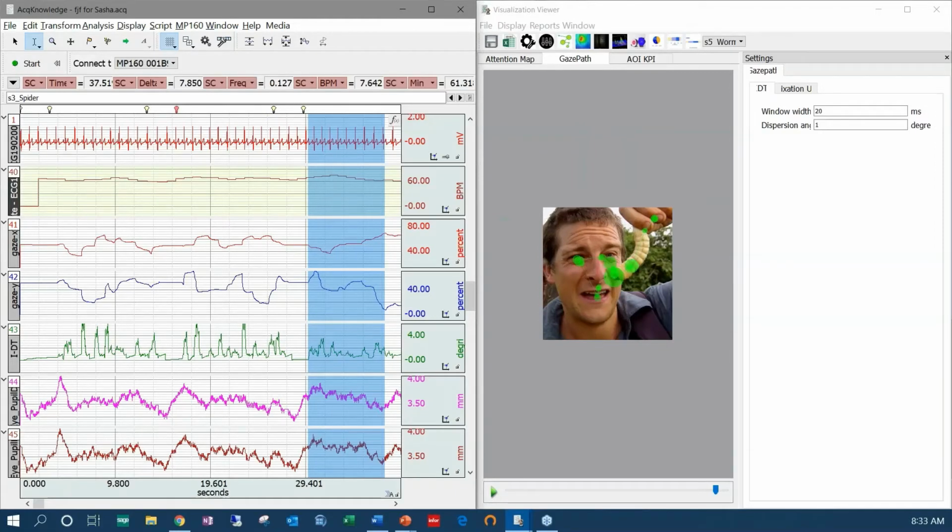Thanks, everyone. Welcome back. So what I've got up on the screen is some data that I actually recorded just before we went live, and I will record other data, but I figured it's helpful to provide you with some familiarization. On the left-hand side, we've got one of our typical AcqKnowledge files. The top channel, red, is ECG. The second channel is heart rate. These were taken from a lead 2 ECG from myself, using one of the ECG 100D smart amplifiers.